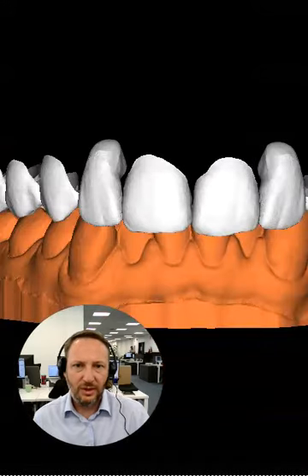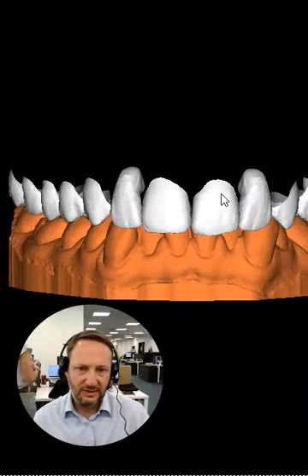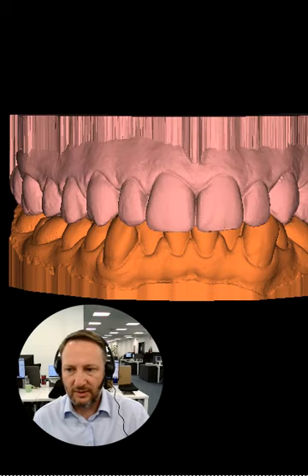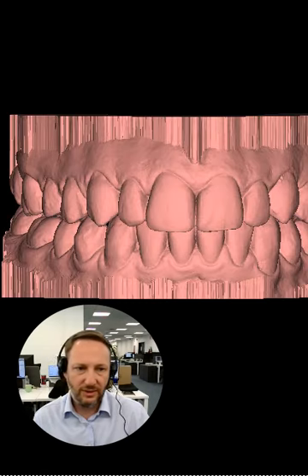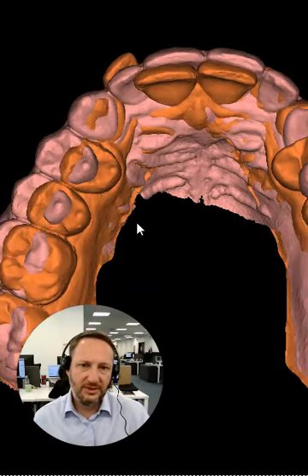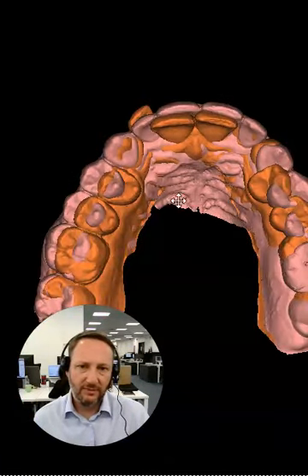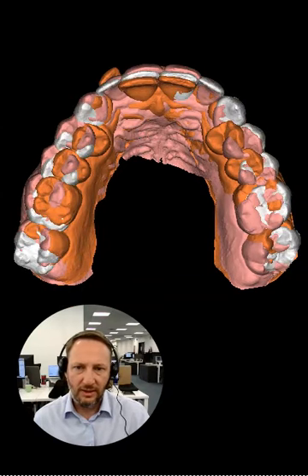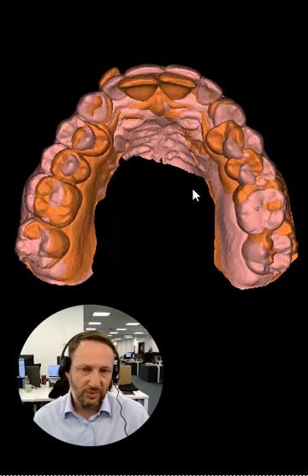Okay, so with this idea in mind and this plan that we performed, we proclined the upper incisors, opened space, and the outcome we achieved so far comparing upper and lower. Let me bring it here again. So this is the outcome we could achieve so far, very close to the plan after one set of aligners. We could expand even more than it was originally planned.